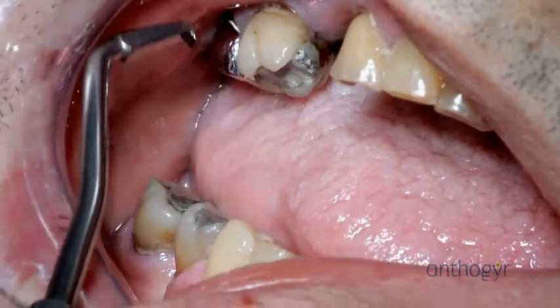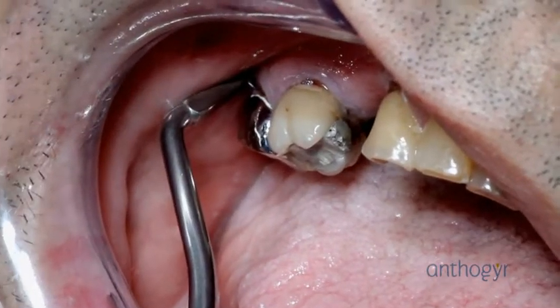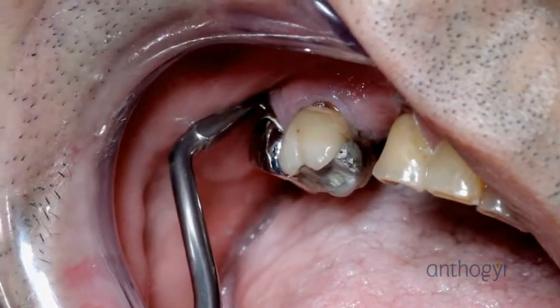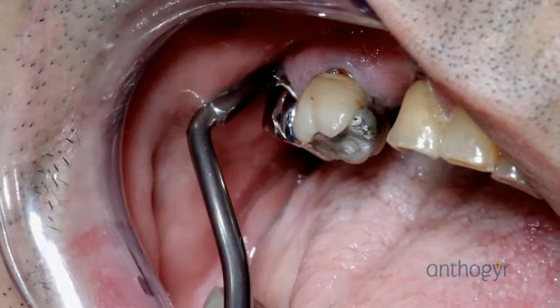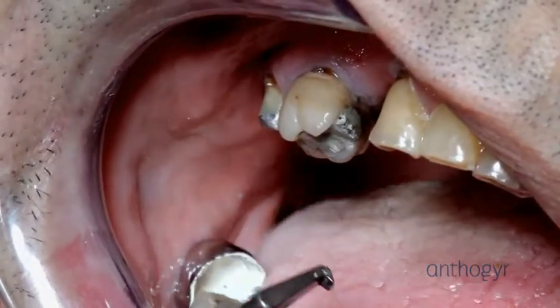A posterior crown is to be removed this time, and an elbow hook will be used. The specific angling of the hook enables loosening of the crown in zones that are difficult to reach. In this case, the hook is placed on the cervical ridge of the crown. It can be noted that the crown's removed very easily without damage to the anchorage beneath.